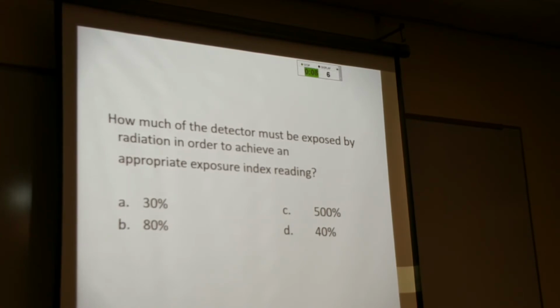So this is more of an imaging plate standard as opposed to digital, okay? So we're talking about maybe a PSP. You can always use a 14 by 17 if you want to do a finger x-ray, but what's going to be the problem?